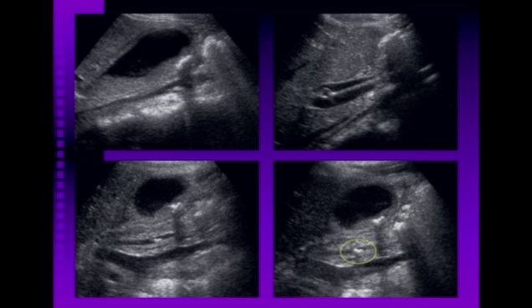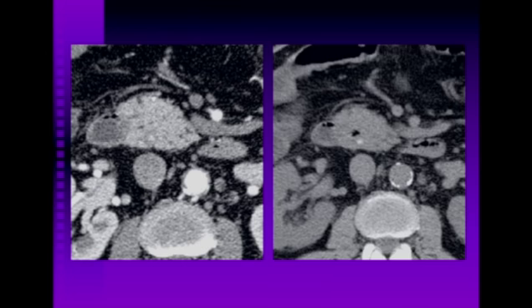So this is a stone within the common duct, otherwise known as choledocholithiasis, and this patient also had a CT. You can see that with contrast it may be actually pretty hard to see, but when we also had the unenhanced CT image, it becomes much more obvious.